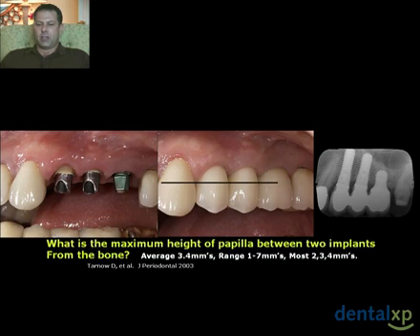And radiographically, you can see why this is occurring, and that is that there's a bony scallop around teeth. That peak of bone on the proximal side is maintaining the papilla more coronally. As soon as you extract teeth and put 2 implants next to each other, because they're flat, the bone will die back. That peak of bone will not maintain itself very long, and that's why you have the soft tissue contour that you do between implants.